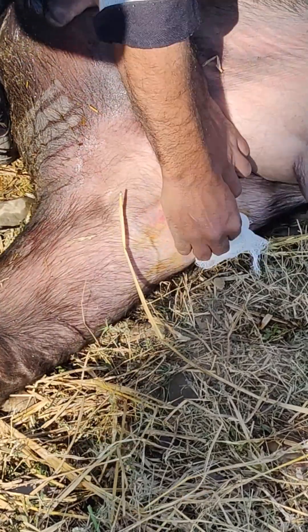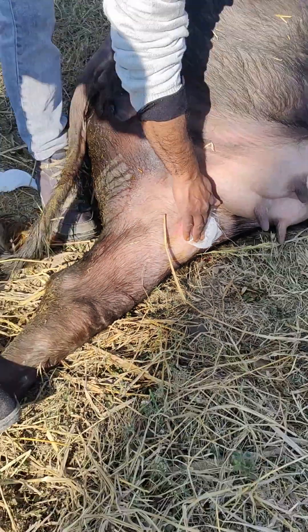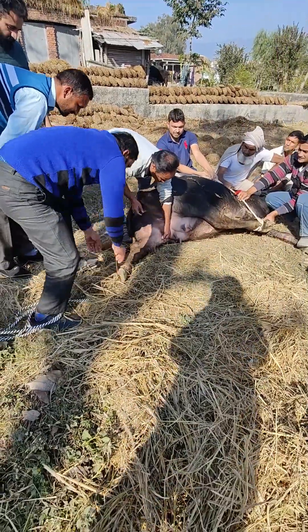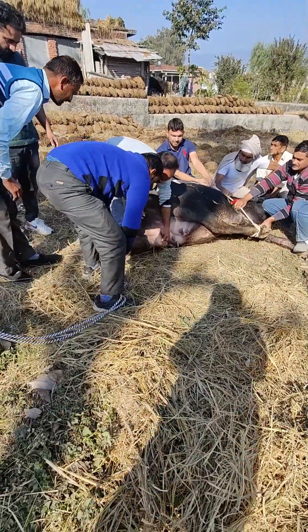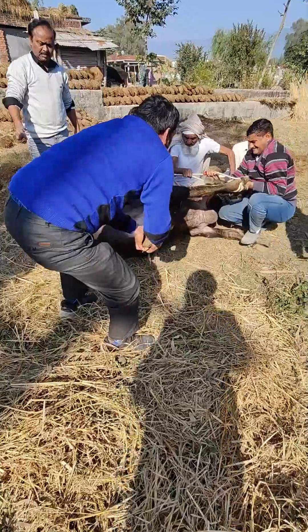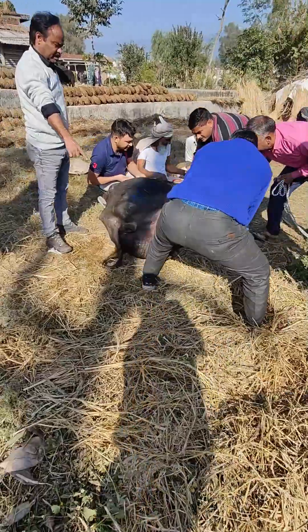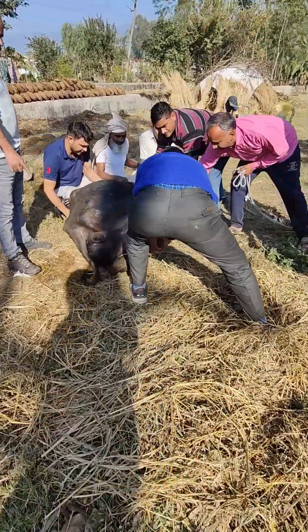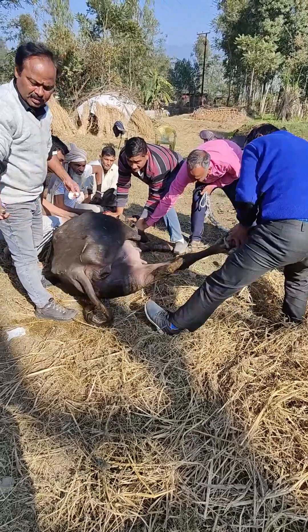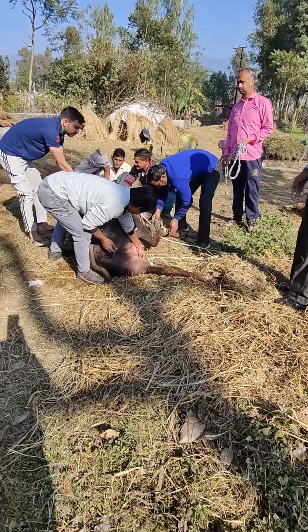The site is then cleaned with antiseptic solution. Bleeding is checked by application of pressure to the site. The limb is flexed three to four times to ensure that any remaining shreds of the ligament are detached. Then the ropes are untied and the animal is allowed to stand up.